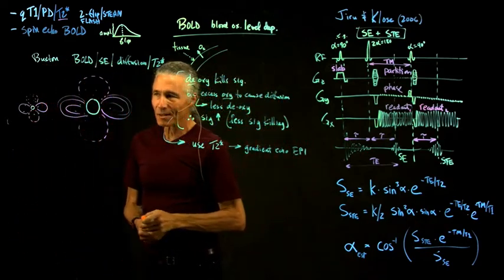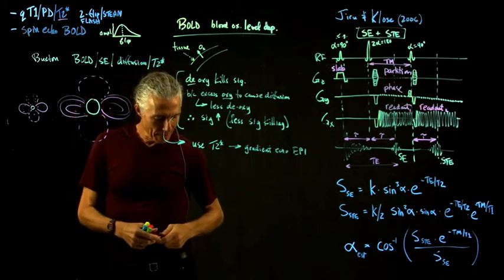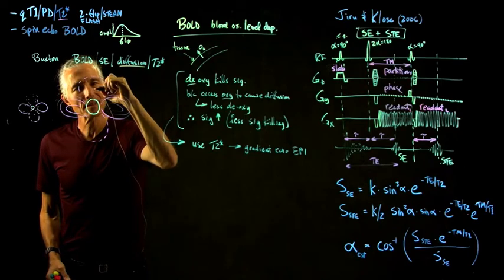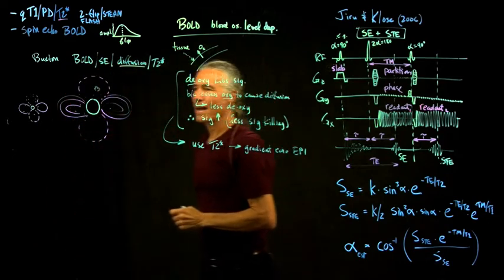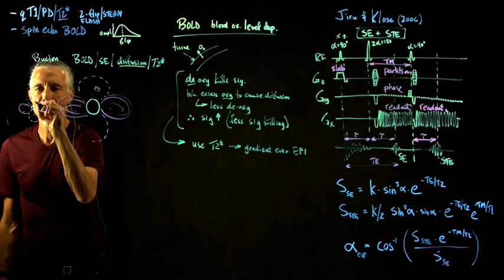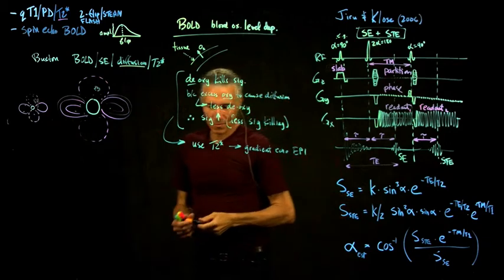Now let's consider a spin. The spin is going to be diffusing around a little bit. So it's wiggling around a little bit, going different places because it's in the tissue. It's a little atom in the tissue. Now here's the same thing around a small vessel. There's a little thing wiggling around, just Brownian motion going around.